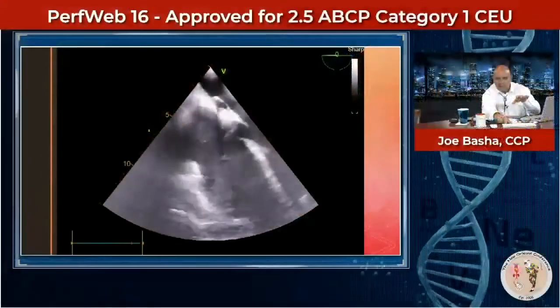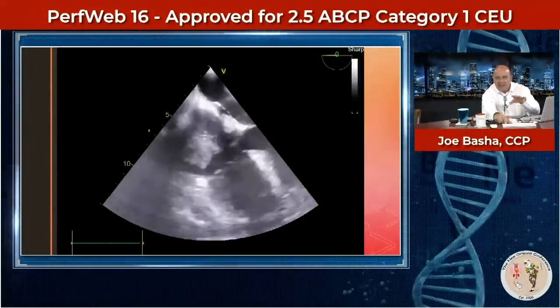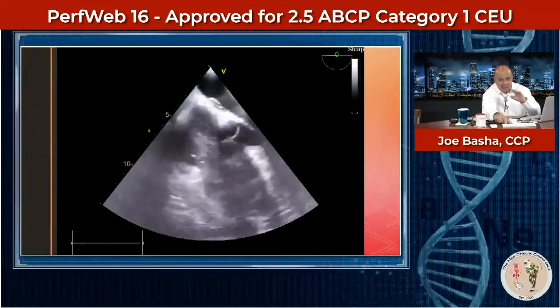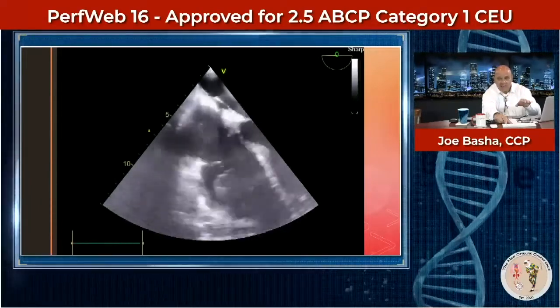So this is what they saw on the echo. Now what happened was that thing that you see there disappeared. It just disappeared. You see it, and then it was gone.